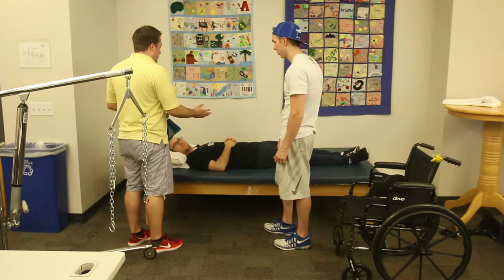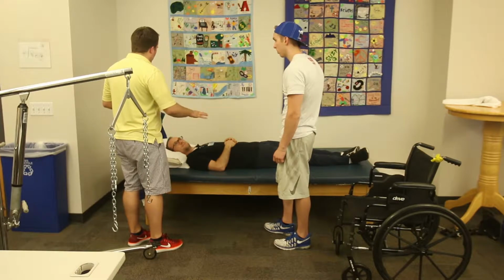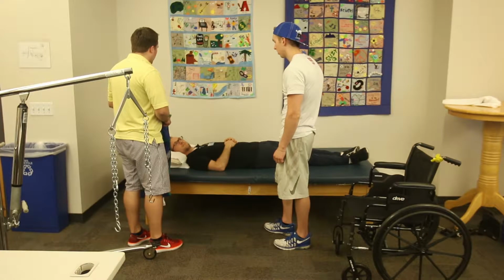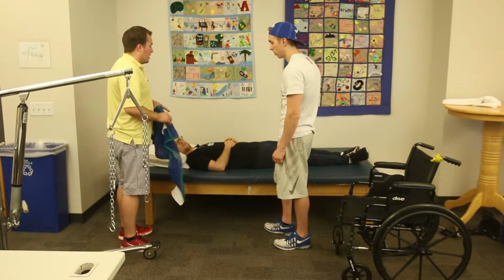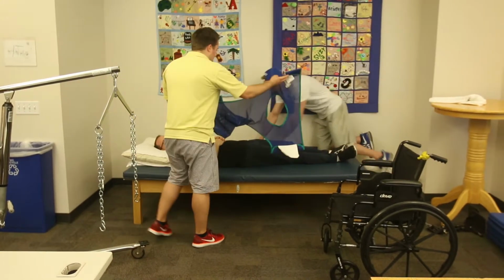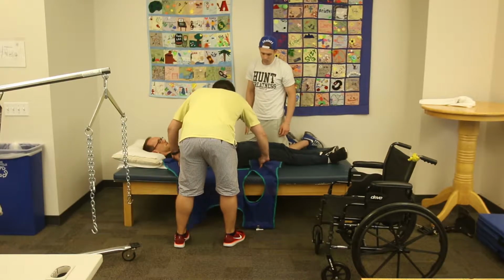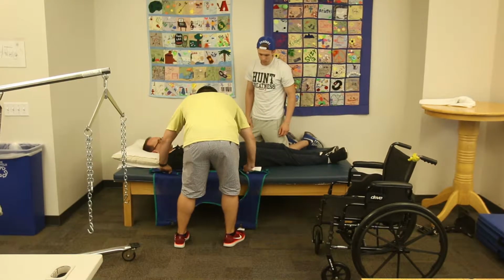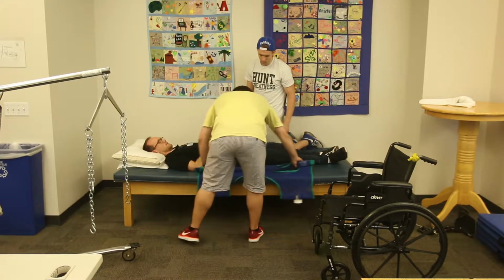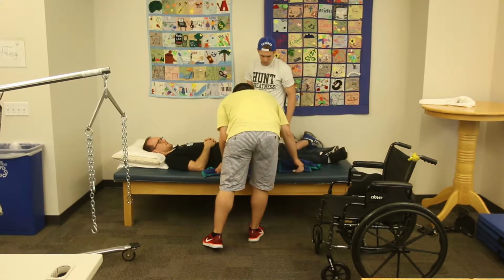So what we're going to do for you, Lucas, is we're going to turn you on your side and slide this up underneath you. Bring you back down. We'll just make sure it's all situated. We might have to roll you a couple times, but we'll let you know what's going on every step of the way. Okay? Good. All right. Jared, if you want to get on that other side of the patient. What we'll do, I'm going to roll this up. Just like that. Set it here so it doesn't fall off the table.